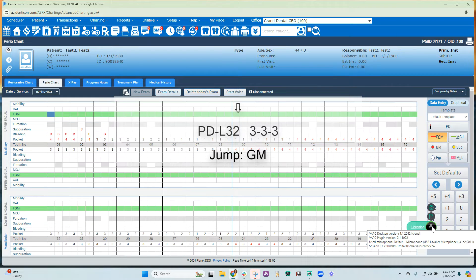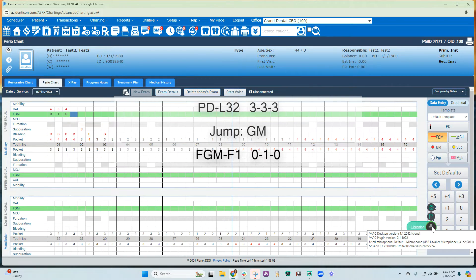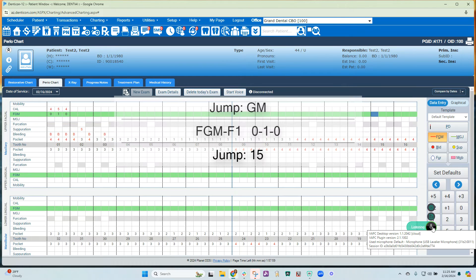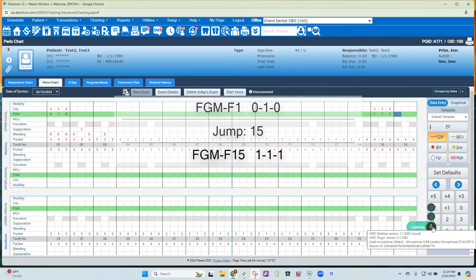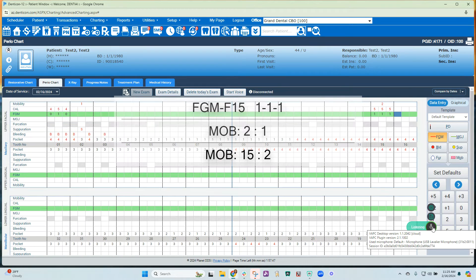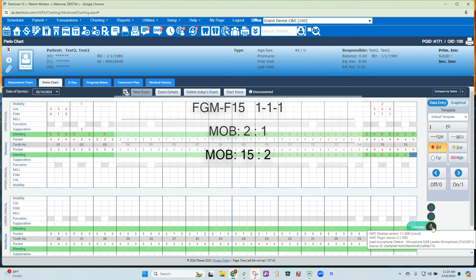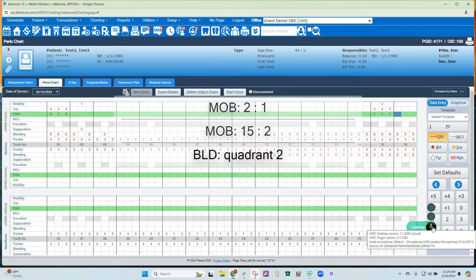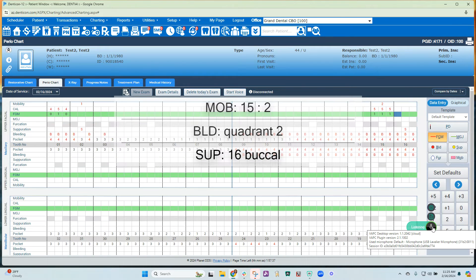0 1 0. Jump 15. 1 1 1. Mobility 2 Class 1. Mobility 15 Class 2.